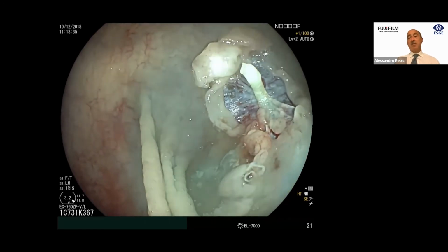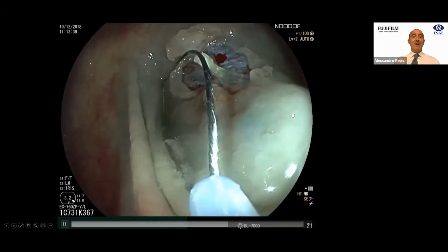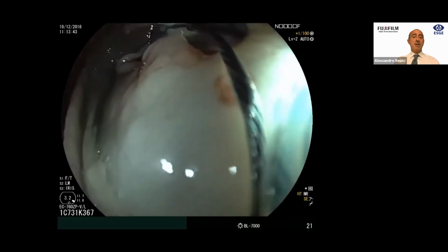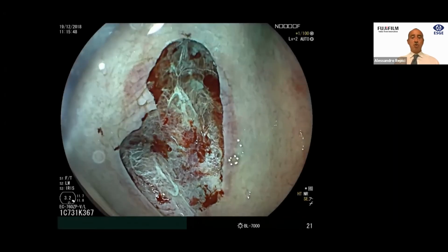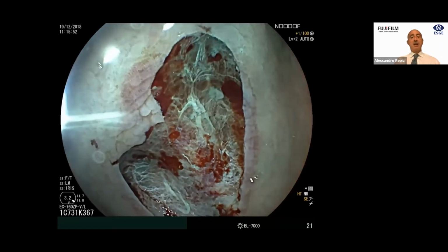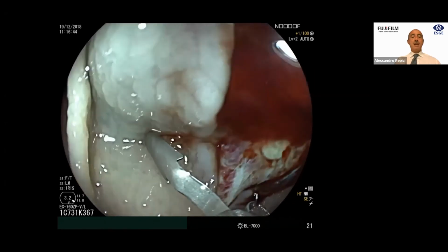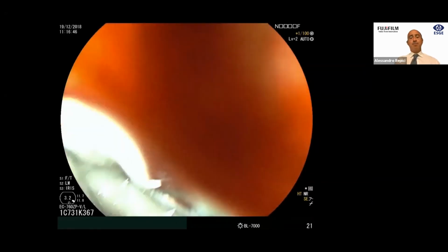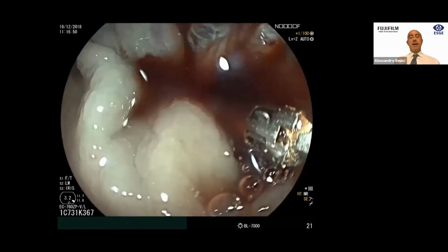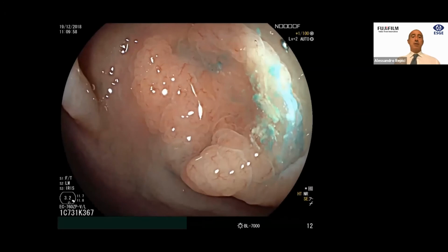And this is a submucosal fibrotic pedicle, and normally if the lesion is about 10 to 15 millimeters, you use a cold snare, a dedicated cold snare. Don't do this with the traditional snare. So just 2 pieces and everything is done. You can use the water pump to again increase the visibility of the borders, and it's up to you. We here applied clips because the patient was taking anticoagulants.